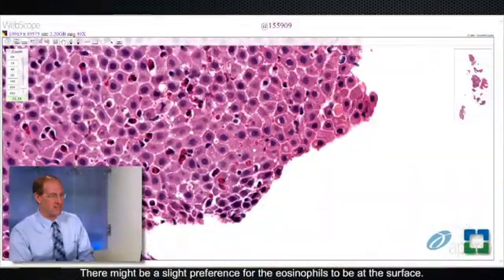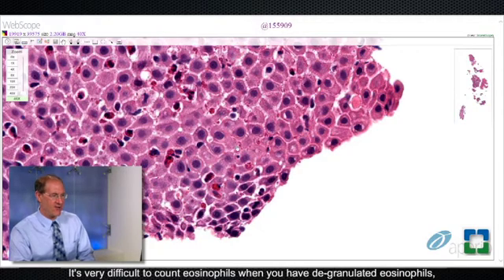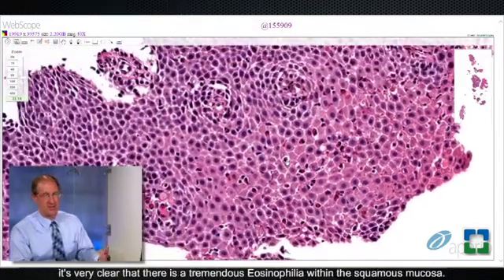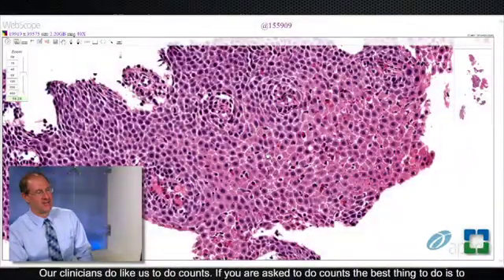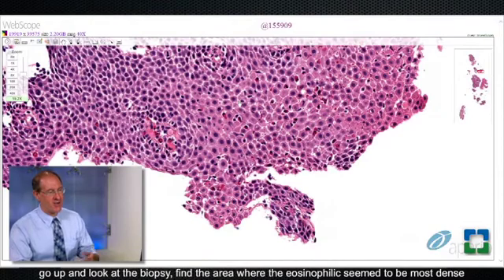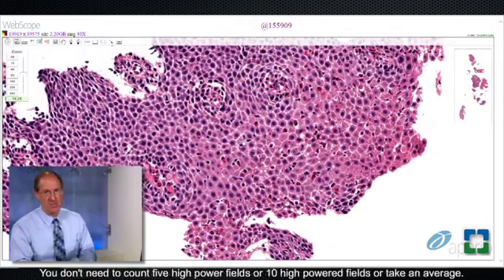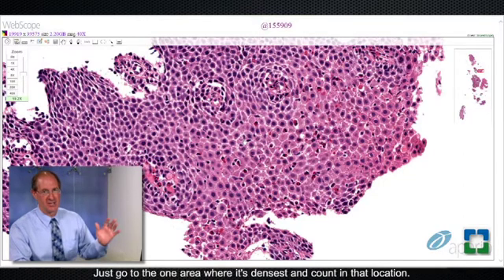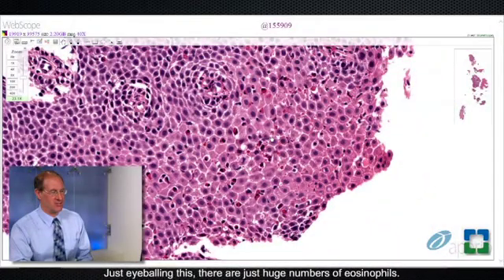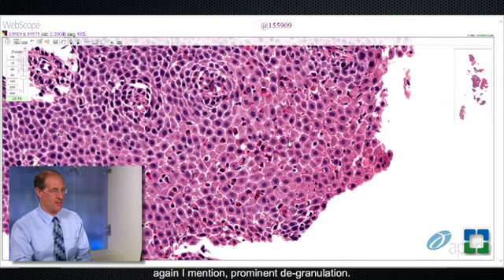There might be a slight preference for the eosinophils to be at the surface. You can see that some of these are degranulated — it's very difficult to count eosinophils when you have degranulated eosinophils, but there's very prominent degranulation. Just eyeballing this, it's very clear there is a tremendous eosinophilia. Our clinicians do like us to do counts. The best thing to do is find the area where the eosinophils seem most dense and count in that location — give a maximum number per high-power field. Just eyeballing this, there are at least on the order of 50, if not more, eosinophils per high-power field, with again prominent degranulation.